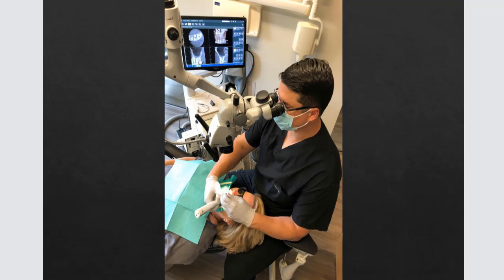So specifically, when we're working on upper molars, left side, maxillary molars on the distal buccal canal, sometimes it's hard to get that file in the right alignment to follow that pathway. Or even today when I was working on a lower mandibular molar, to get on the left side, to get into the mesiobuccal canal. Sometimes you have to take the handpiece, and if you look here, I call this handpiece inversion, but I have it flipped over so that I can get into position.